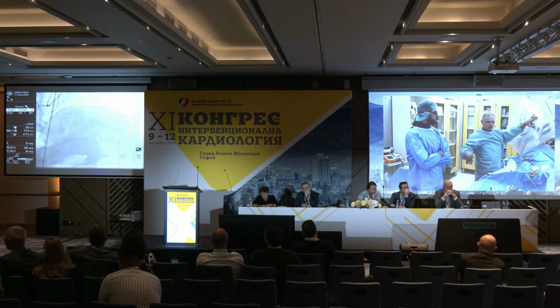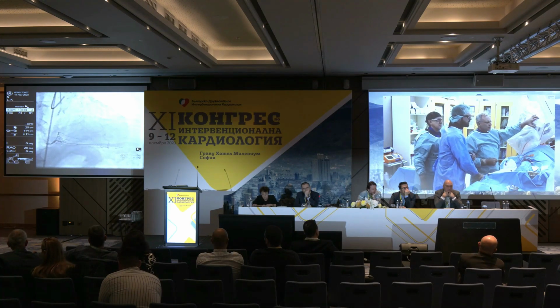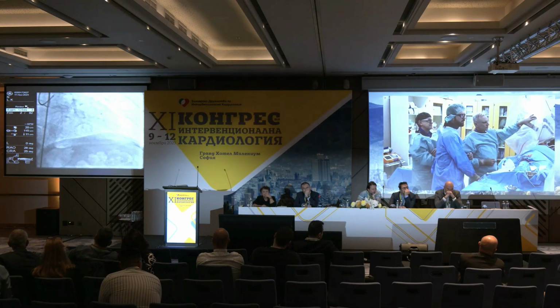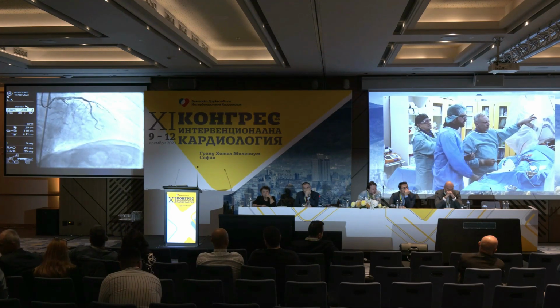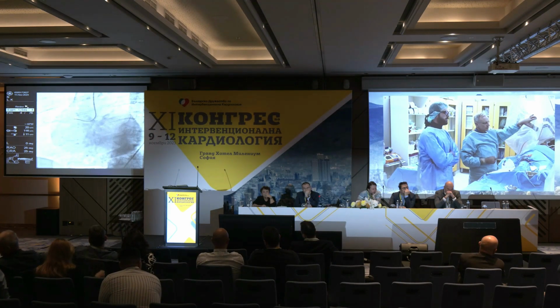Let's go to this projection. We are going to work there. You see also the circ is occluded, but it's a small vessel. So what we faced here, we did some additional filming to clarify better the collateral circulation. Definitely it's well developed, many septal collaterals.